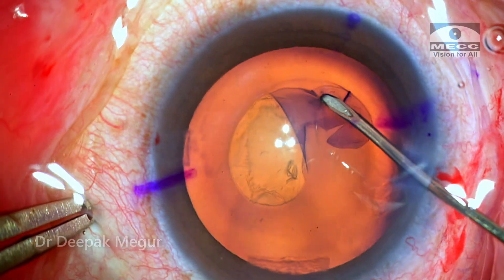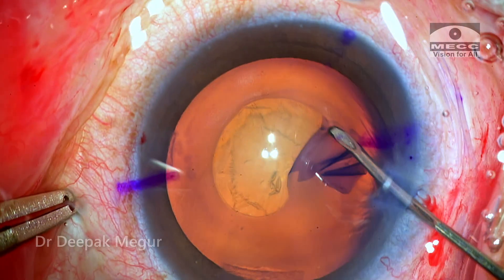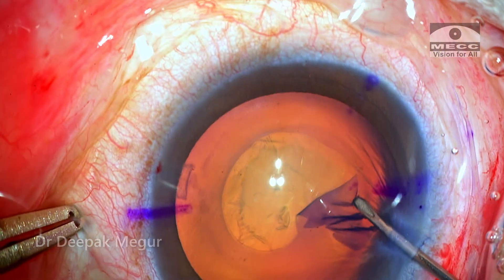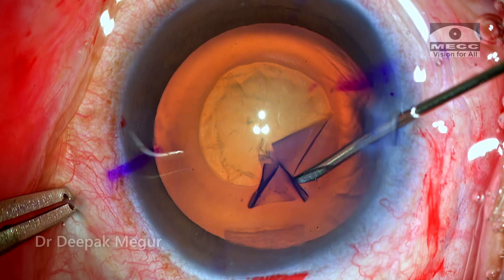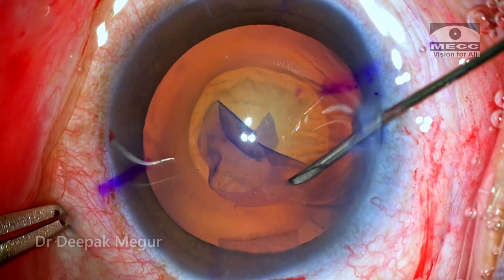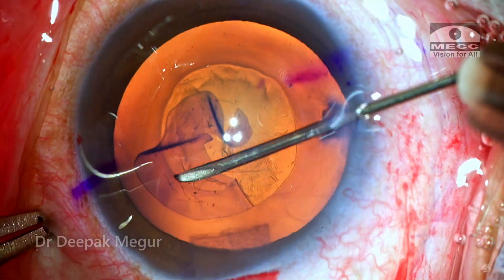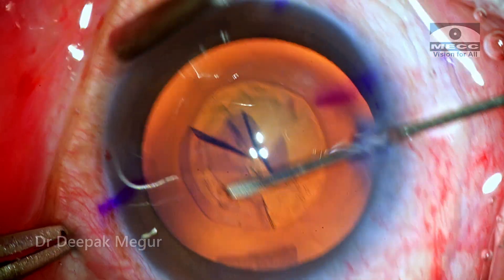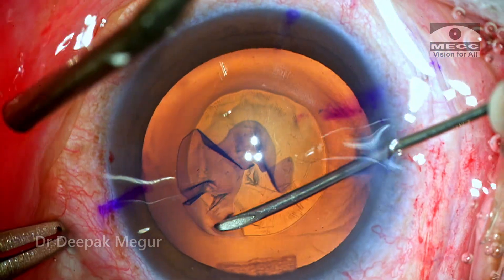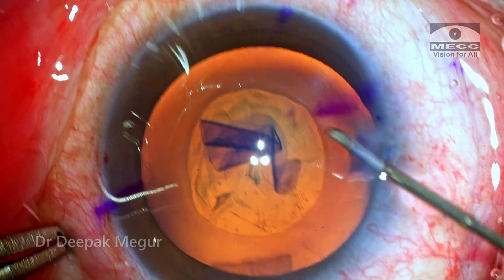Getting the right-sized rhexis is especially challenging because the pupil will be extremely well dilated and there will always be a lack of judgment, because the reference point — the iris which we usually take — is obscured when the pupil is extremely big in these eyes. It helps to use corneal rhexis markers in certain situations, but in this case I have not used any. It looks alright now — let us see how it appears once we implant the lens.